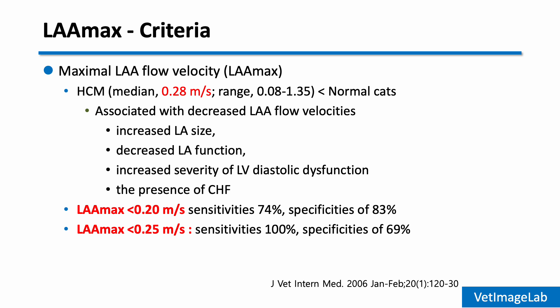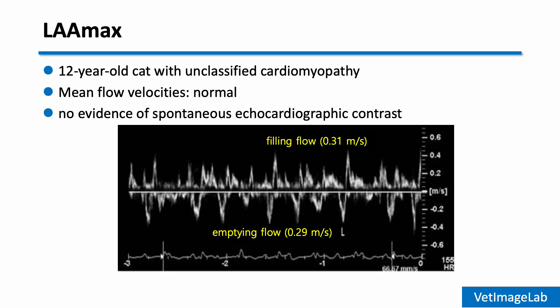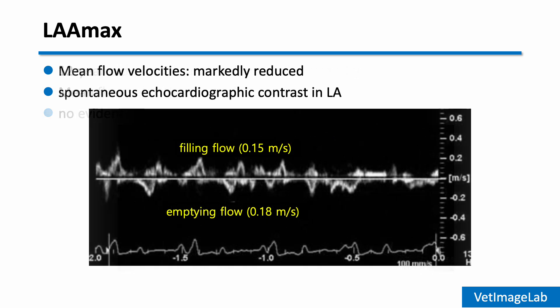These values are not used alone — we interpret them together with LA size and visual findings such as spontaneous echo contrast. In the first case, the LAA max is over 0.3 m/s, which is within the normal range, and there's no spontaneous echo contrast observed. In contrast, the second case shows severely reduced flow around 0.15 to 0.18 m/s, and spontaneous echo contrast is clearly visible. This cat is at high risk for thromboembolism.